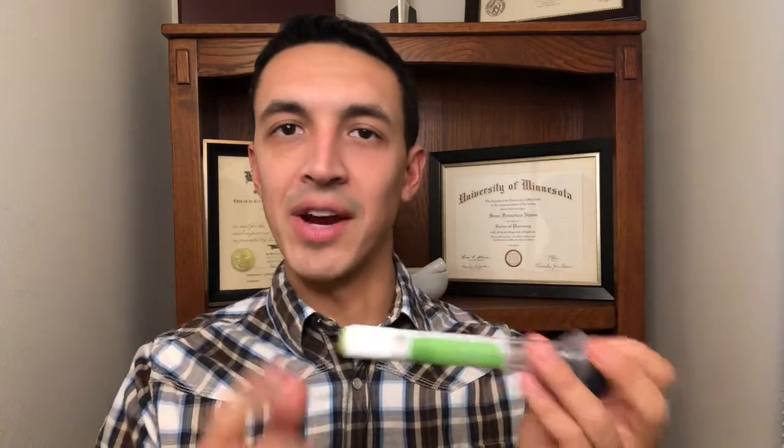My name is Sean Navin and today I'm going to be talking about Trulicity. So Trulicity is an injectable medication for people who have type 2 diabetes. So if you were just prescribed Trulicity, you may be wondering, how do I inject this thing?